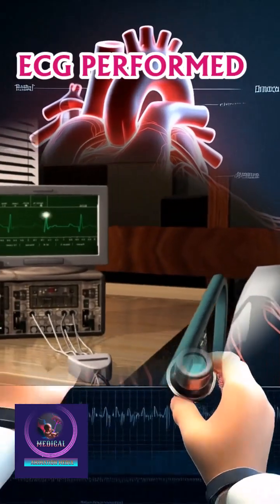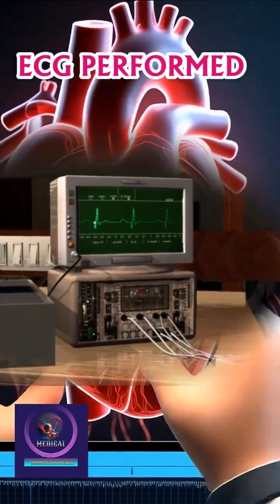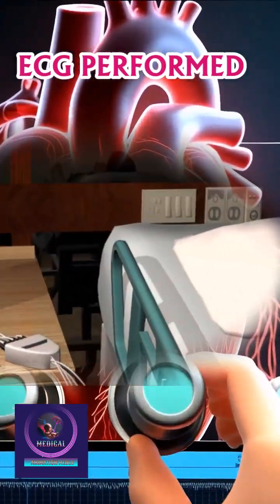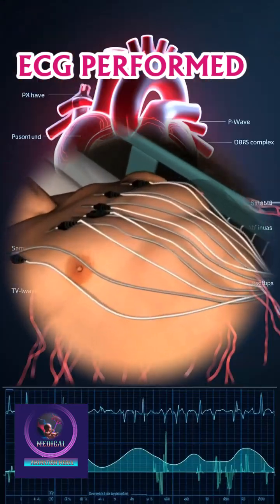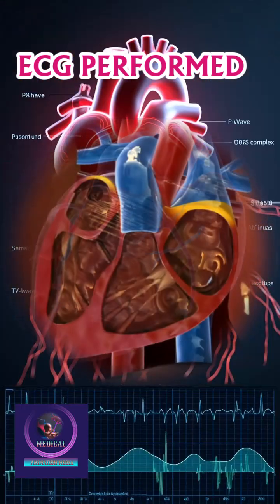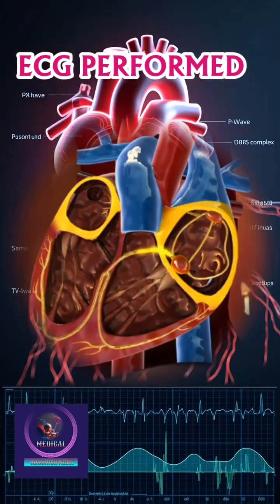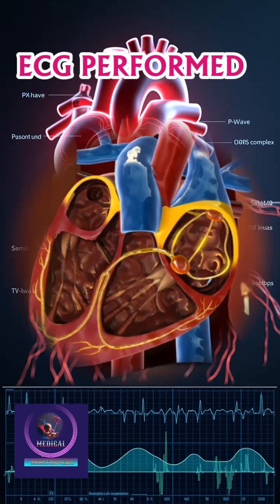To monitor the normal activity of the heart, a test called an electrocardiogram (ECG) is performed. Let's take a look at a cross-sectional view of the heart. Within the heart, a cardiac impulse travels through its chambers, causing the heart muscles to contract and relax rhythmically.